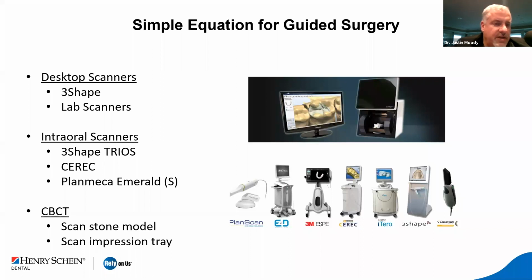Also, almost every intraoral scanner outputs an STL file. Now, some of them do it without any pay per click, some of these do it without any encryption, but almost all of them do it. We have the 3Shape Trios scanner, CEREC, most people have known, and Planmeca. We have the Planmeca Emerald S at New Horizon, which we use on a literally daily basis, but truthfully, it's almost on a patient basis. We use it almost every time with our patients.